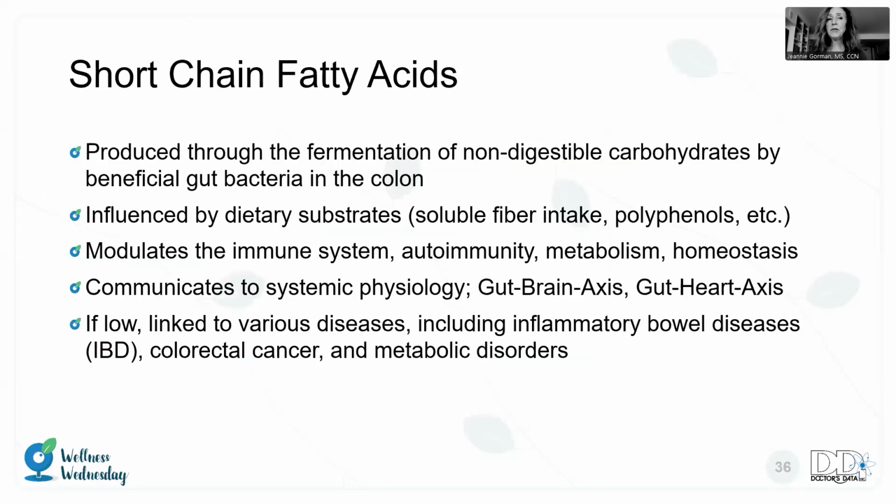You may already know this, but the short-chain fatty acids are produced by the beneficial microbiome. If there is a patient that is in need of support of probiotic or soluble fiber, you're going to already be directly supporting the short-chain fatty acid production. So those 2 sections, the stool chemistry section and the beneficial microbiome, play off of each other.